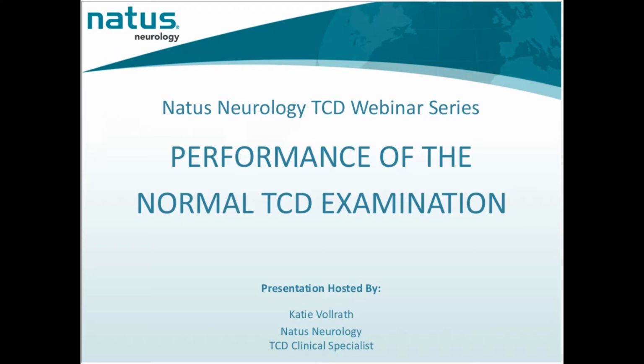Today's topic is performance of the TCD exam with special tips and tricks.